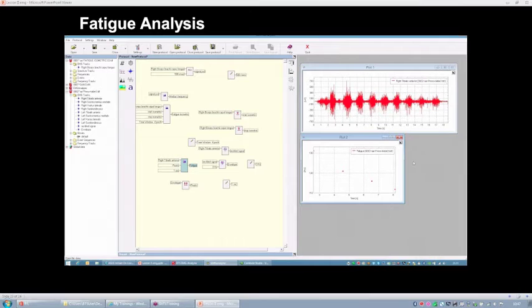During these 2 lessons, you have learned about the main algorithms that are commonly used in EMG applications. So now you should be able to use them within our EMG analyzer application, and I think that you can start to develop your own protocol.